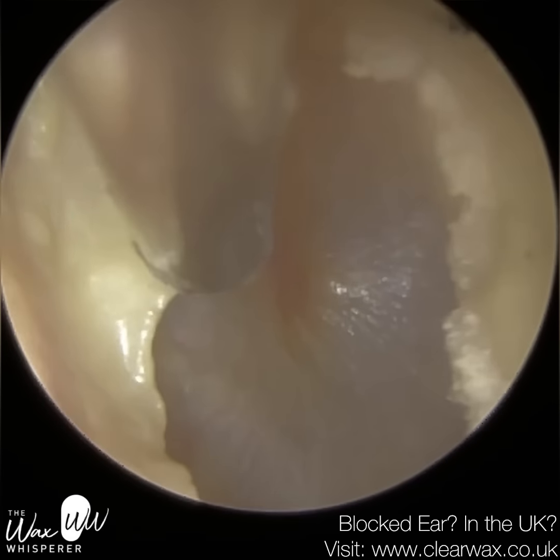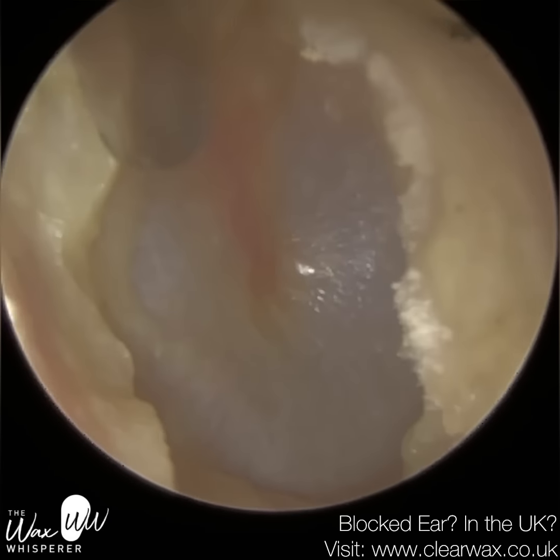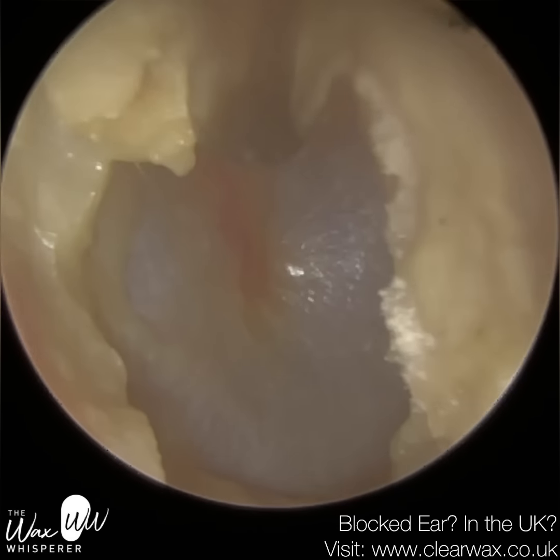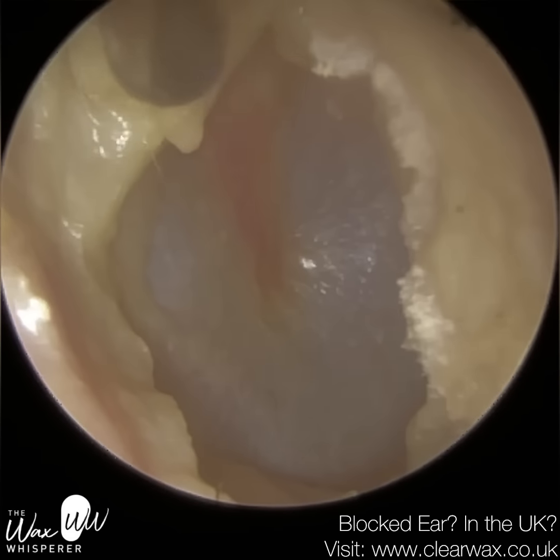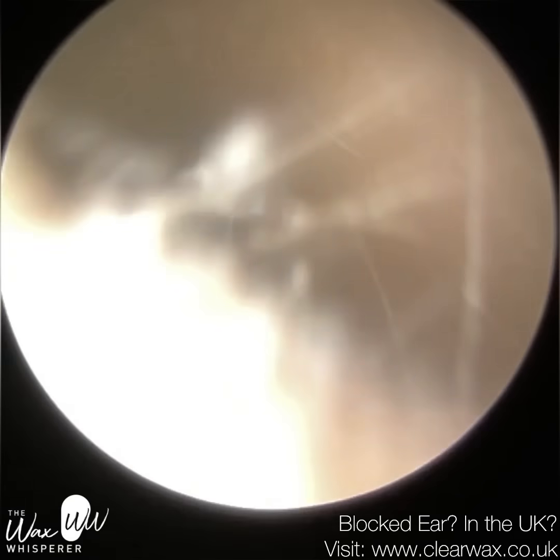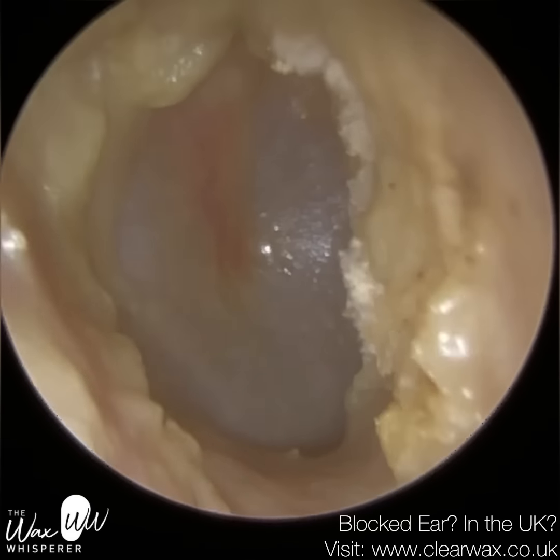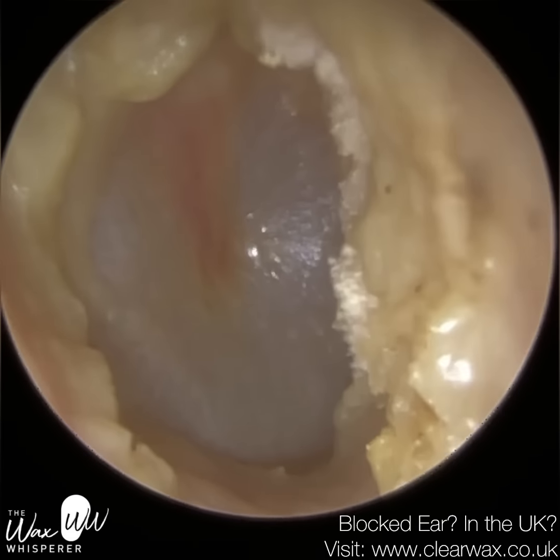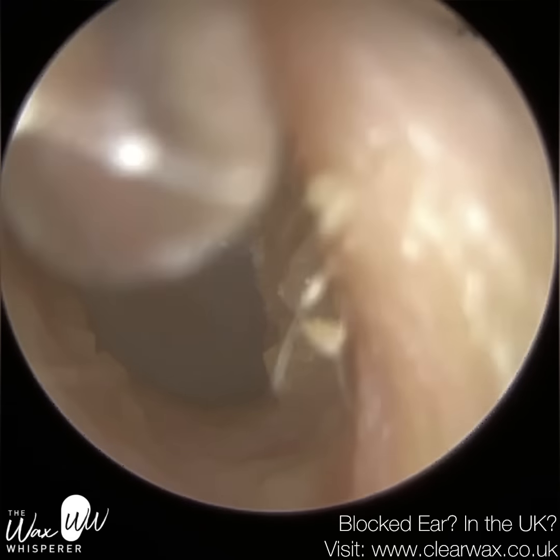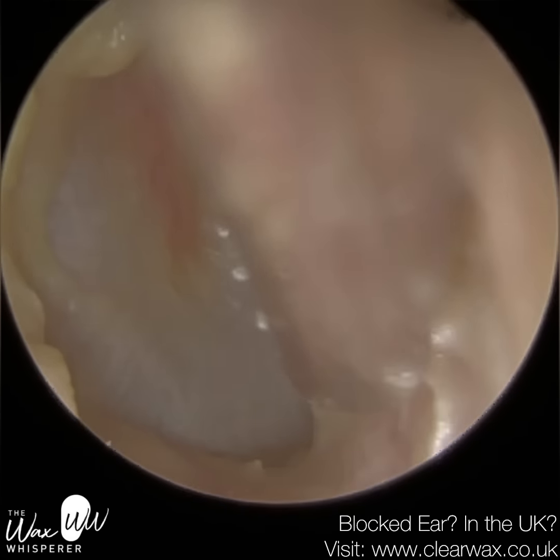Again, this is far more inflamed, swollen. The eardrum's fully visible already, so the patient can hear significantly better. I'm just going to spend a bit of time now to remove as much debris as possible. I think there was still some residual debris just at the roof of the eardrum, but we actually went onto the eardrum and kissed the surface, and it wasn't coming away. So we've got to quit whilst we're ahead sometimes, because if I persevered any more, we may have caused some trauma to the eardrum, which is the last thing we want to do.